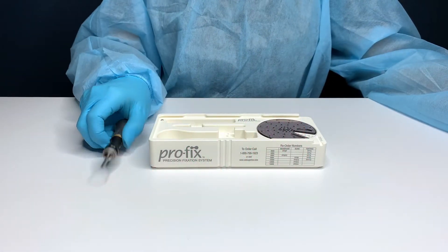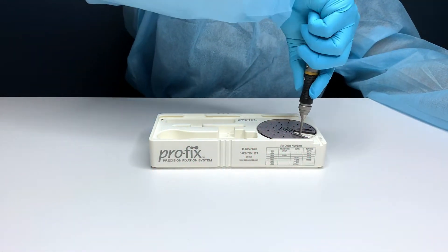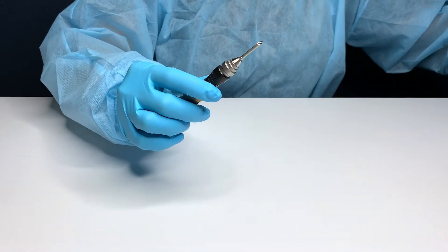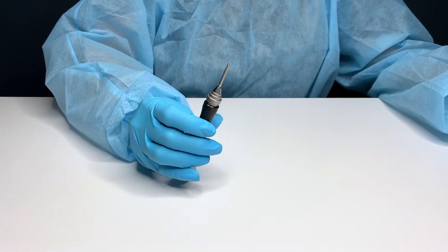There is no magnetization or outside mechanism that maintains the secure connection between the blade and the screw. Due to the friction fit connection, the screw is designed to not disconnect from the driver blade in the case of dropping the handpiece or sudden movement.